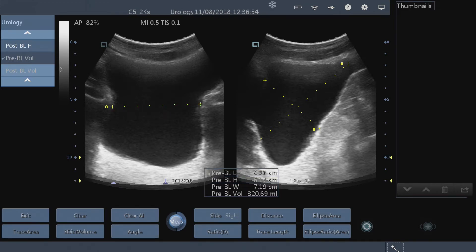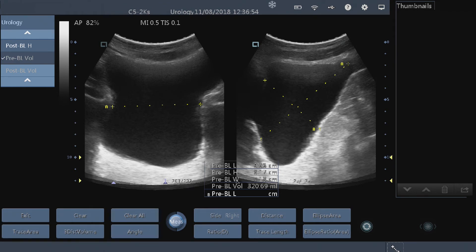We've gone left to right on the transverse, and we've gone caudal-cephalic and anteroposterior on the sagittal image. Then we've got our pre-bladder volume — length times width times height times a correction factor — which gives us 320 mls as our bladder volume.